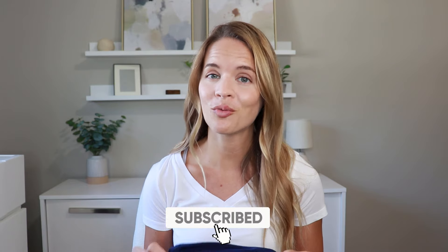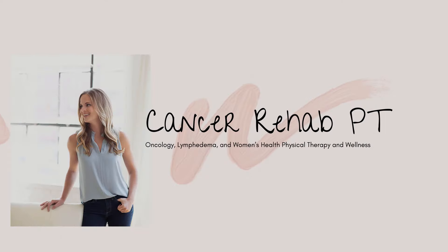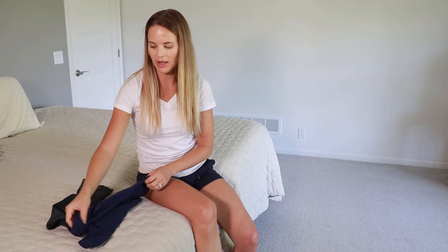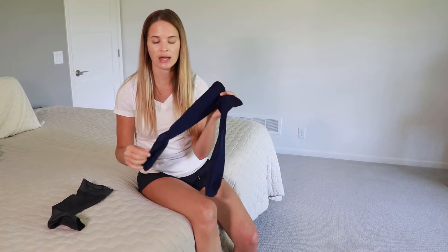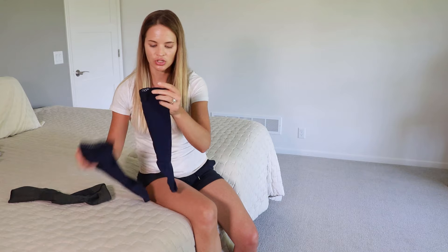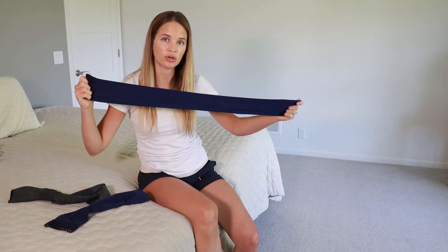But if it's still a struggle to get them on, don't worry because I'm also going to share different tips and tools that you can use. I have basic 20-30 mmHg pressure, which is a medical grade stocking, and I also have a flat knit for those who have more of a custom stocking. The compression stockings are going to be really stretchy.